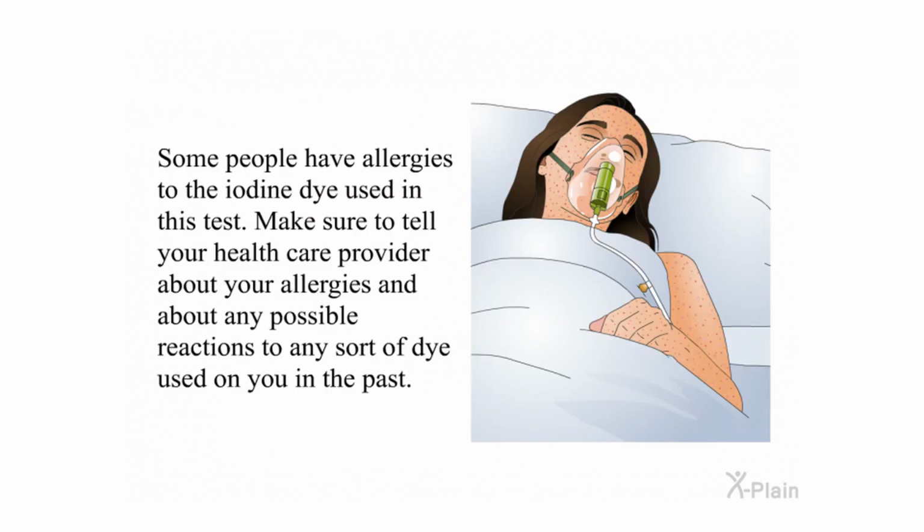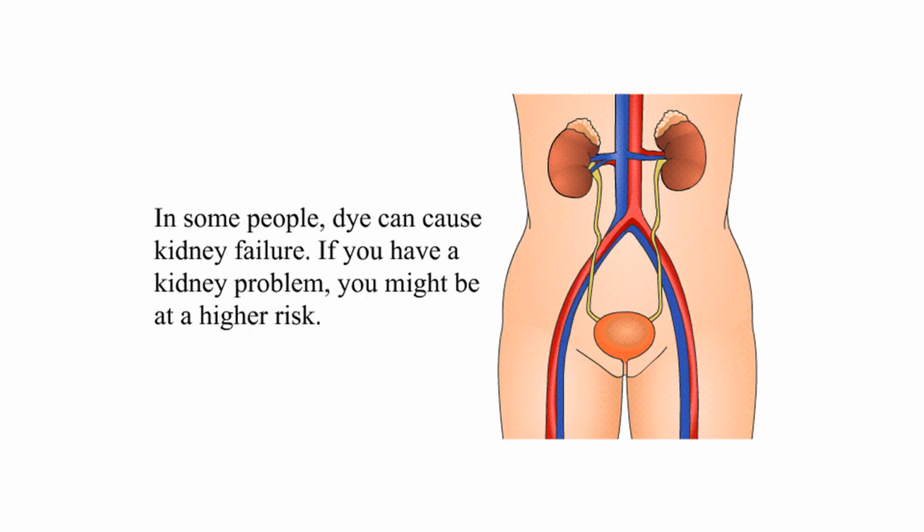Some people have allergies to the iodine dye used in this test. Make sure to tell your healthcare provider about your allergies and about any possible reactions to any sort of dye used on you in the past. In some people, dye can cause kidney failure. If you have a kidney problem, you might be at a higher risk.